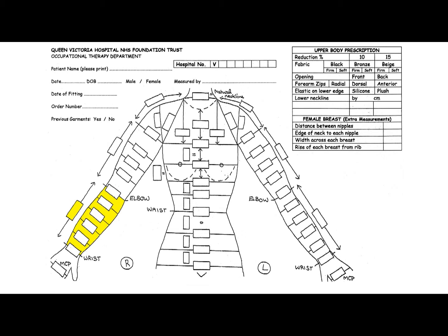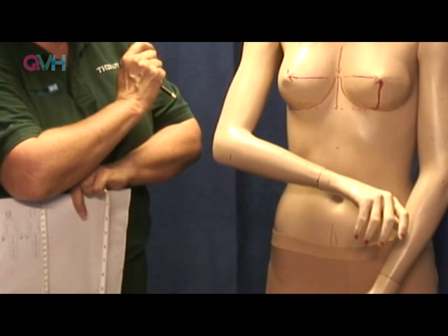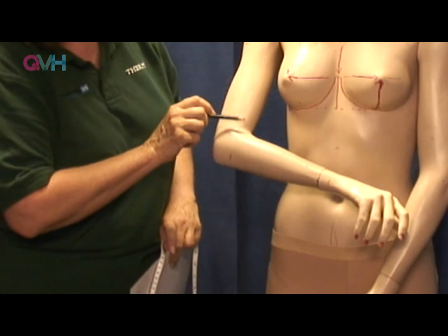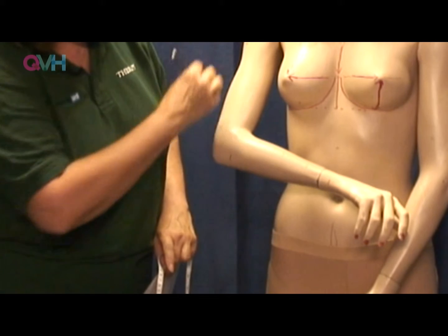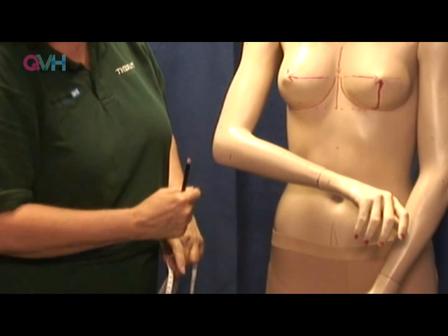And we'd have to be aware that when the arm does fully open, it needs that distance, but it also needs, if you're not going beyond there, the sleeve would need to end there, or if you were only doing a short arm sleeve, it would need to end there. But if you're going the whole length, you need that elbow measurement and those distances.